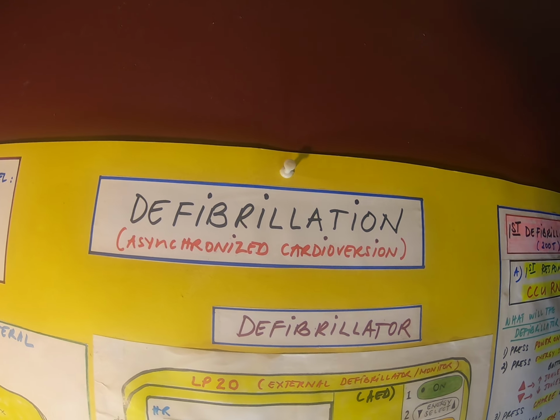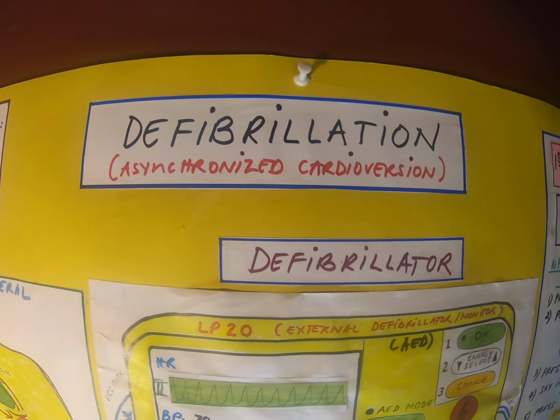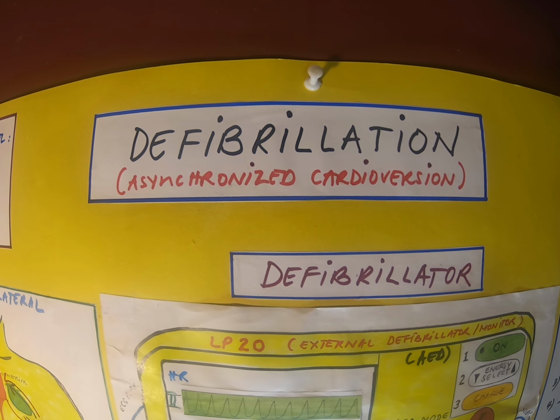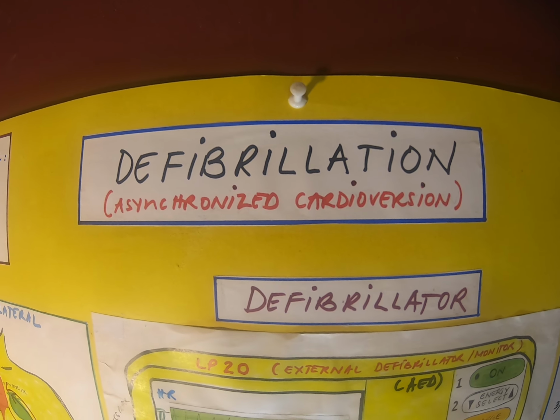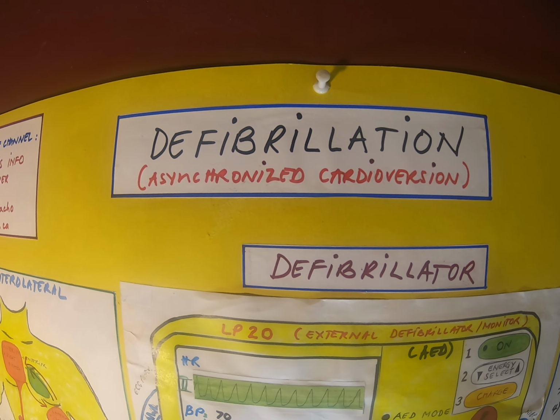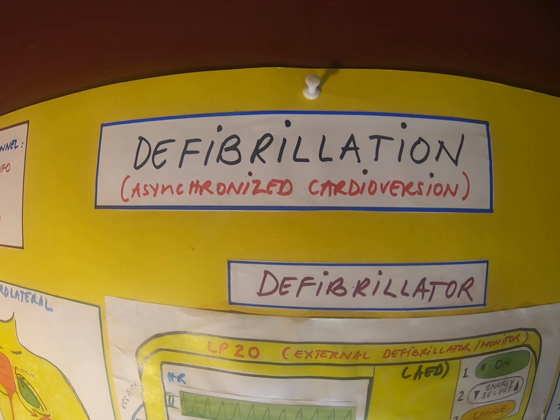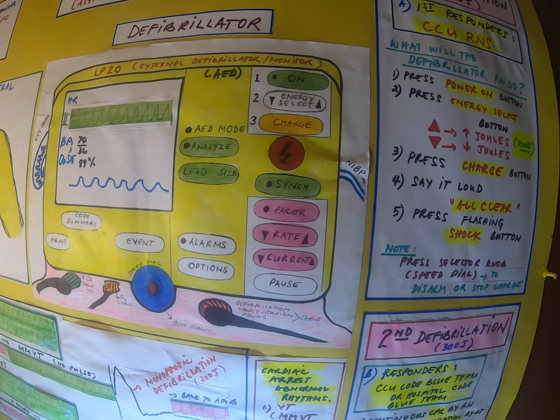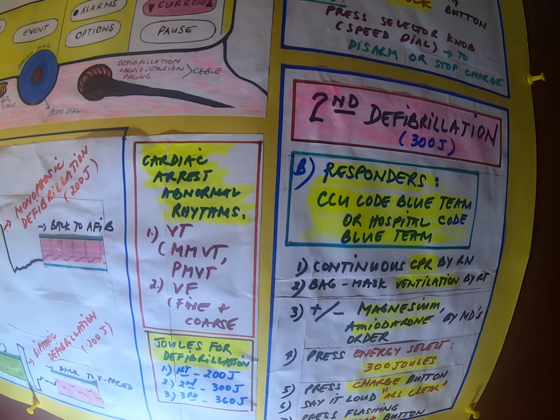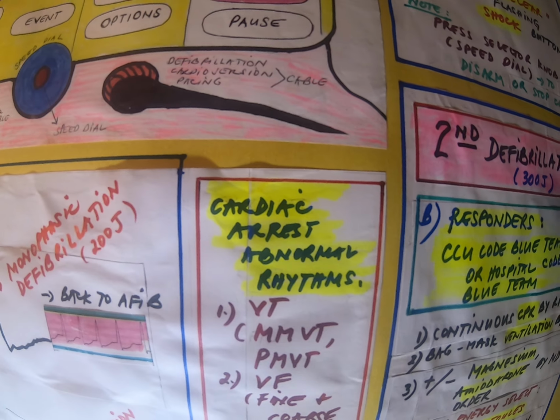Defibrillation or asynchronized cardioversion. This is my last video, or my third video, about management of pulseless ventricular tachycardia. When we speak of defibrillation, this is the application of electrical shock to the heart muscle right away. So we have cardiac arrest, abnormal rhythms, that need defibrillation.